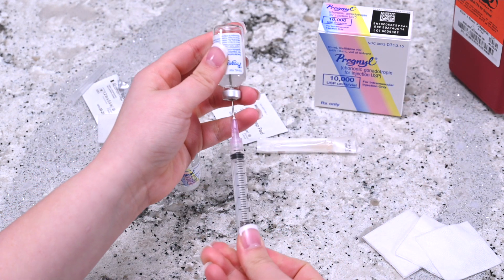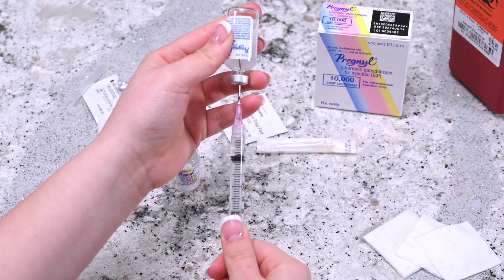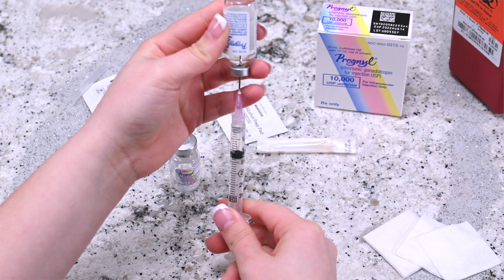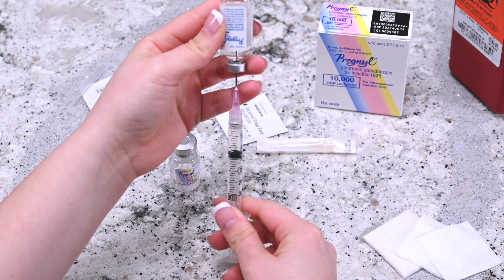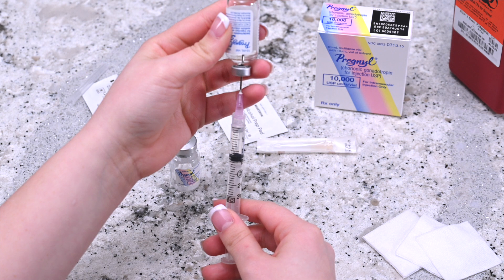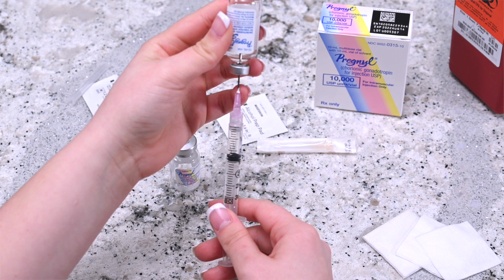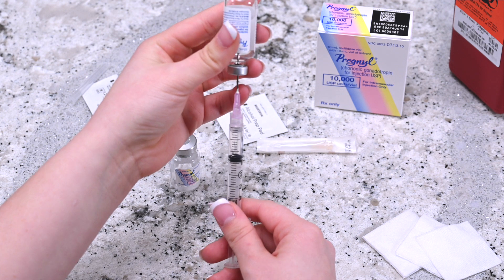Invert the syringe so that the vial is upside down but still attached to the syringe. Make sure that the medication submerges the tip of the needle. Pull back on the plunger of the syringe and measure the proper dosage.